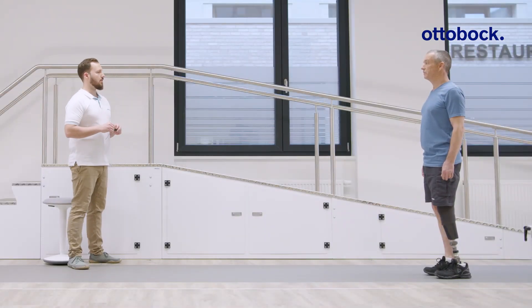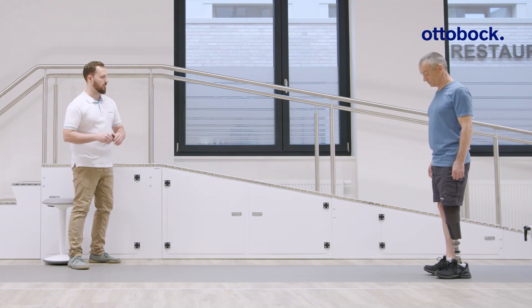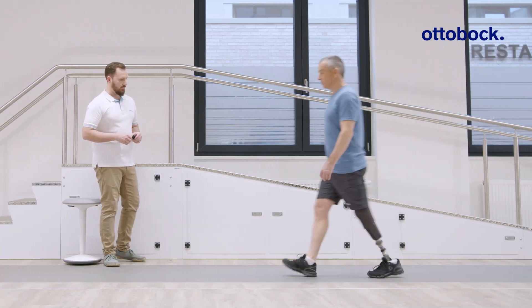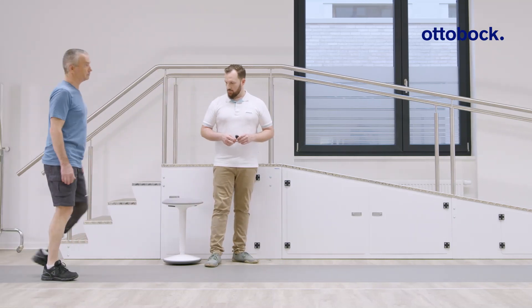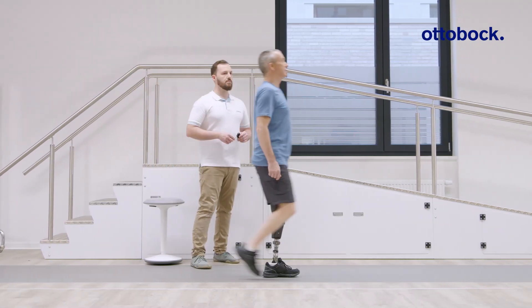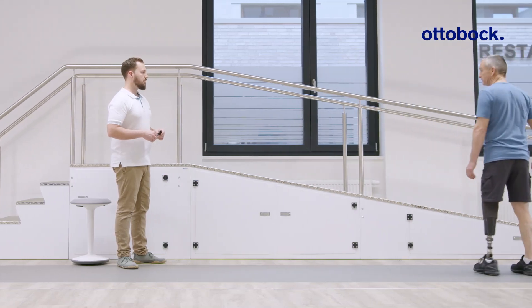Before optimizing the resistances of the Taleo ADAPT, allow the user time while walking on level ground with middle-of-the-range resistance settings. Observe the whole body movement as well as the behavior of the foot and knee.